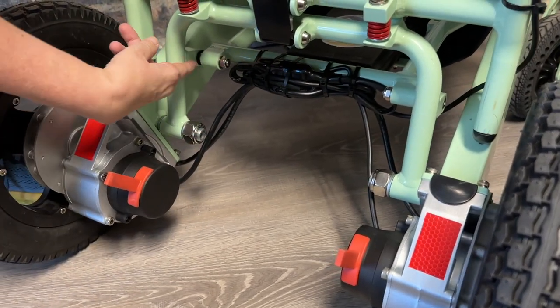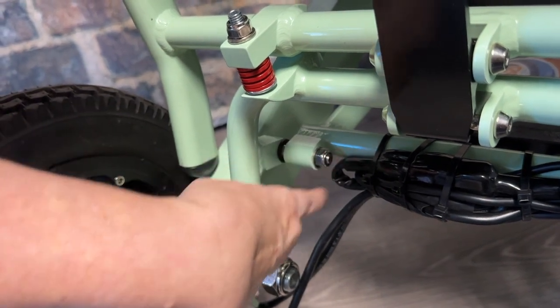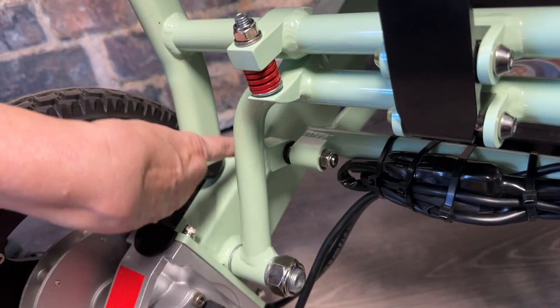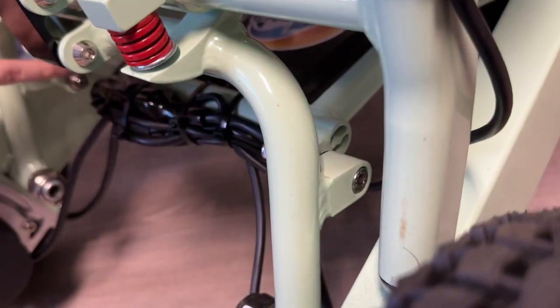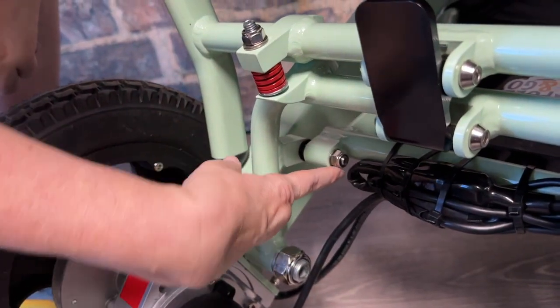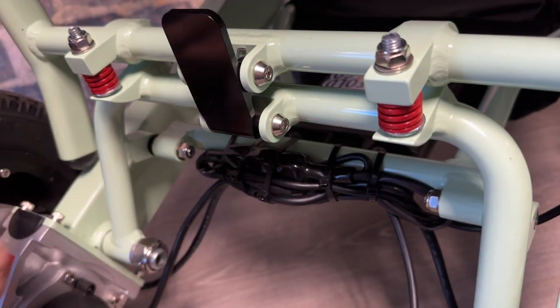The last bolts to look at are right by where the cables are zip-tied. Spot check both of these bolts — if there is a gap, make sure to tighten those up. This concludes the video. If you have any additional questions after watching this, feel free to contact our service department.